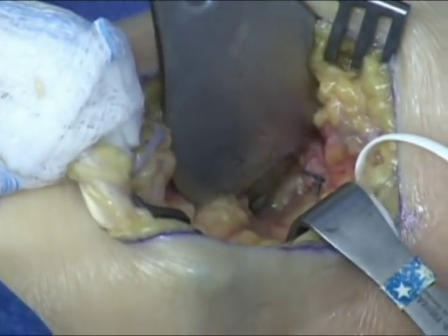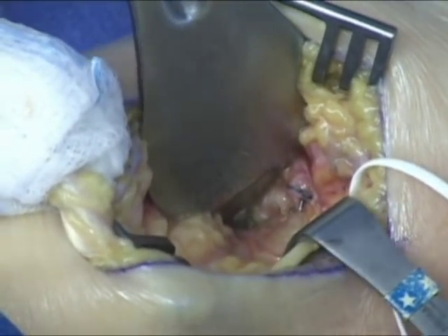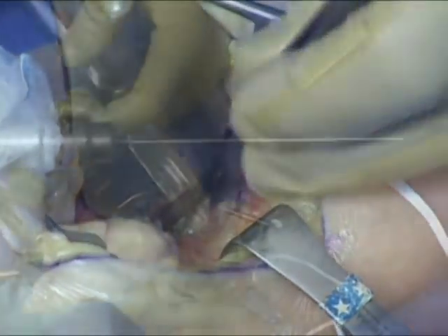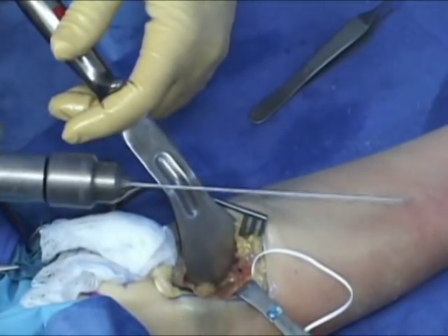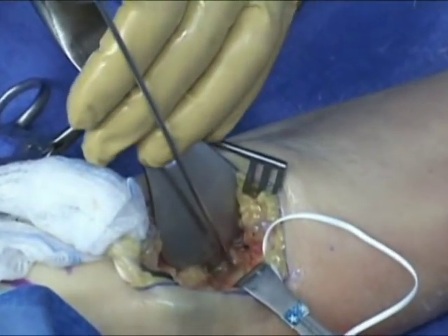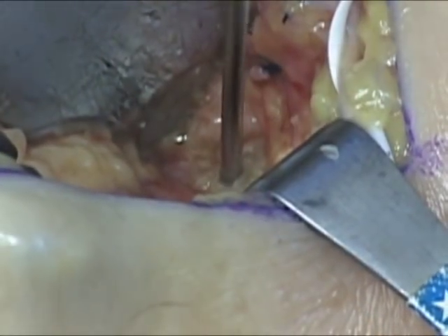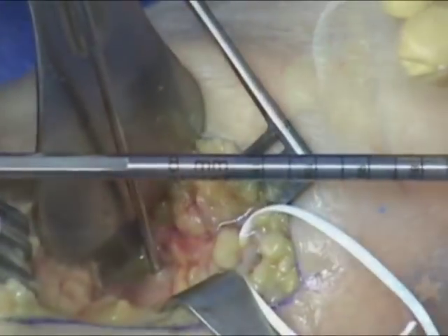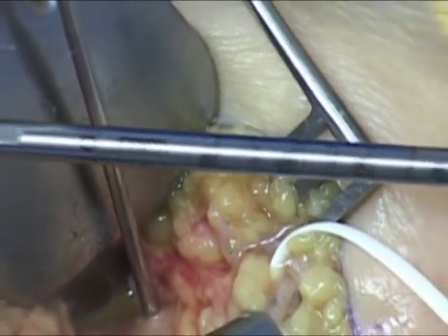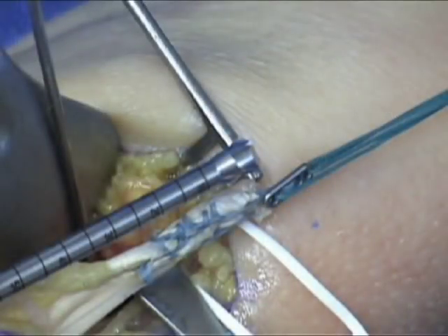A portion of the tendon can sometimes be identified on its ulnar aspect. The tunnel for biceps fixation will be created nearer to the ulnar margin of the large biceps tuberosity footprint in an attempt to restore the windlass effect of the biceps tendon on supination. A guide wire for an anterior cruciate ligament cannulated drill is then placed on the ulnar aspect of the biceps tuberosity with the arm held in full supination, drilled just to penetrate the posterior cortex. An 8 mm ACL cannulated drill is then chosen based on the measured diameter of the ruptured tendon.